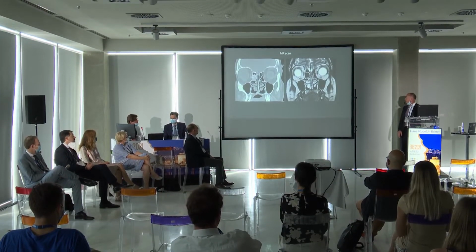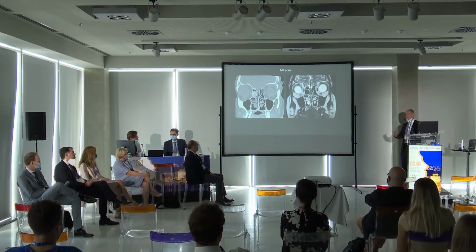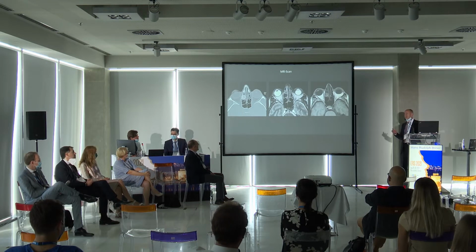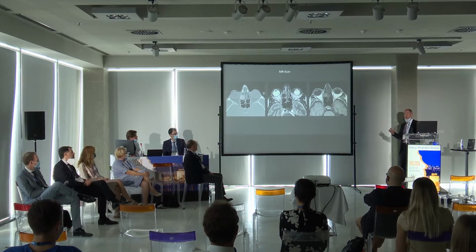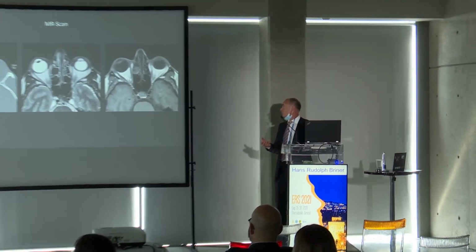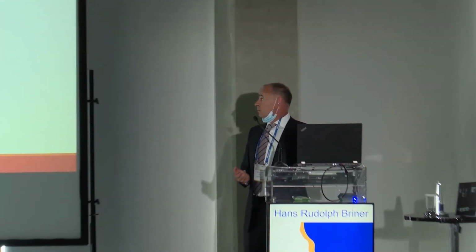And here you see the MR scan, not a lot of additional information to the CT scan, but still it has some benign look. Well, we are here on a roundtable about benign sinus tumors. It must be more or less a benign tumor. So, lesion of benign fibro-osseous aspect in the right anterior ethmoid. This was the radiological diagnosis. What shall we do? Wait and see. It does not really look malignant. Who would go for wait and see? Please raise your hands.